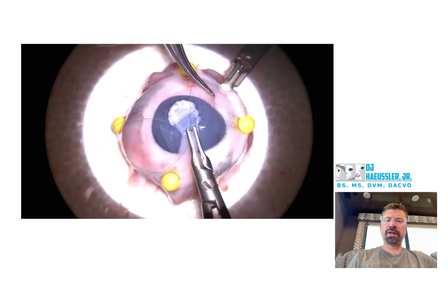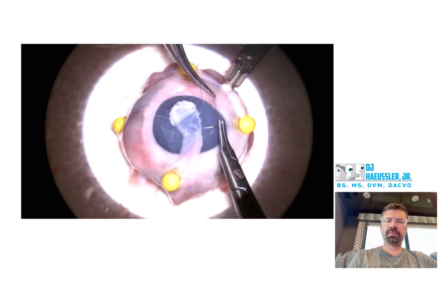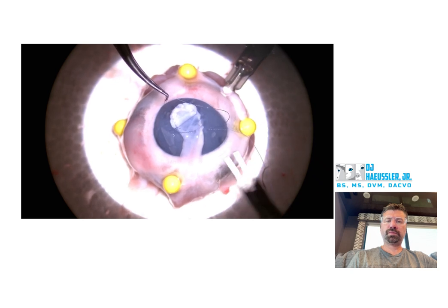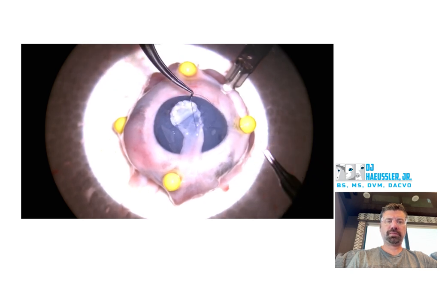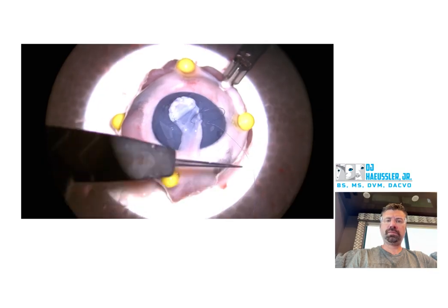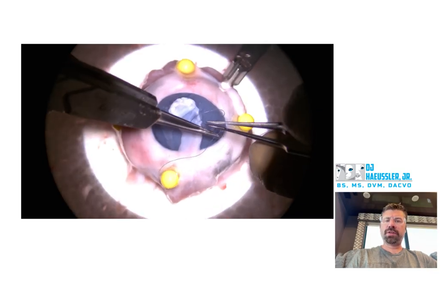Good job — you grabbed your cornea right here with your colibris to stabilize that cornea before driving that through. Good job switching over to tying forceps.